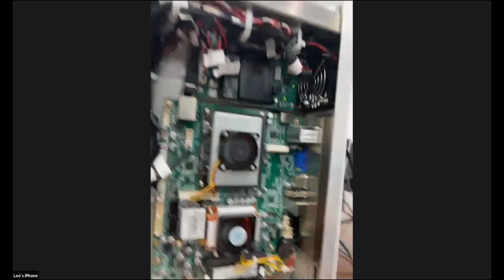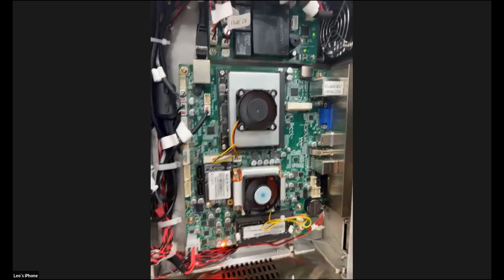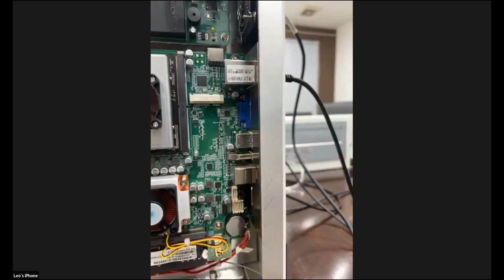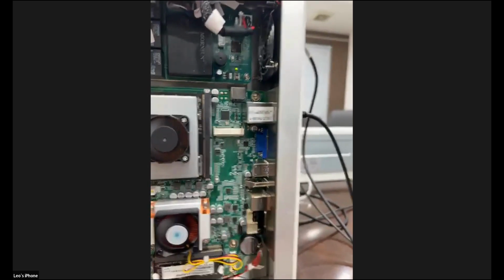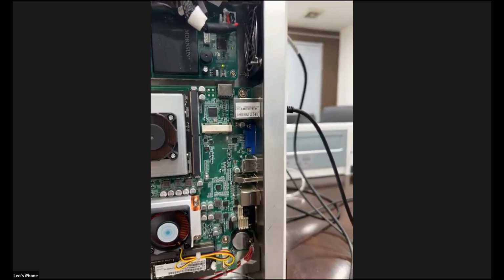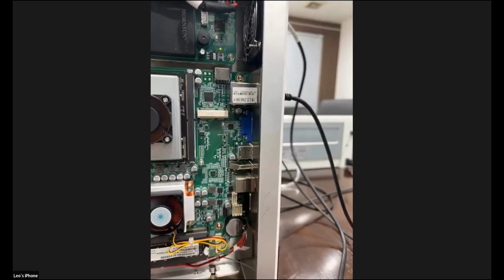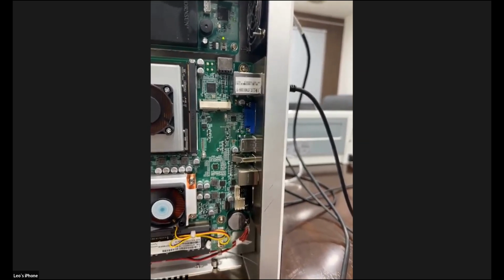And from here also is a very big and important board. We can call this board the industrial control board, because it includes the GPU, like Mr. Chuck just introduced just now. It has a GPU and the hard disk, and also we have the RAM and the disk.